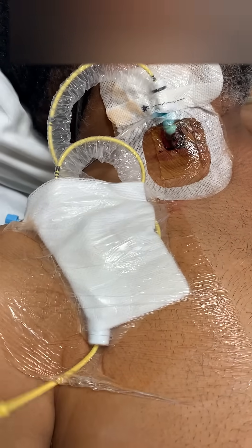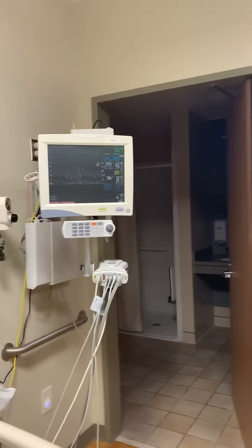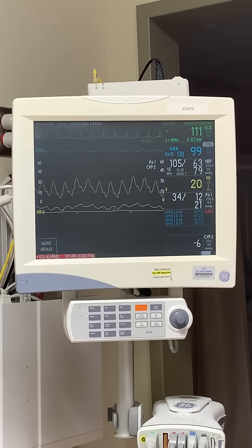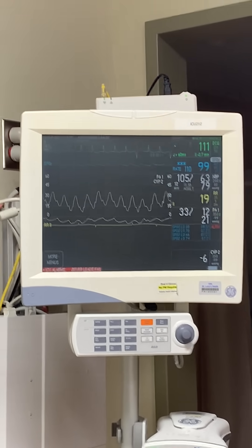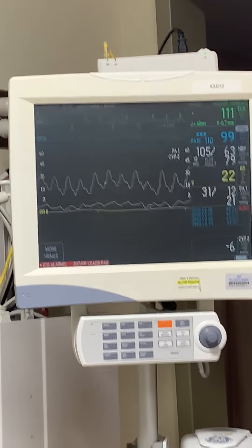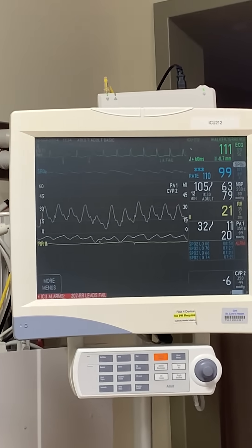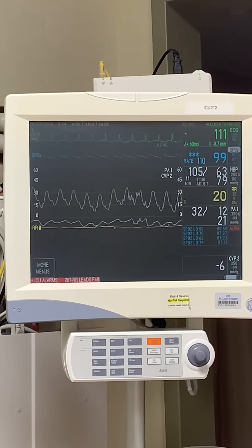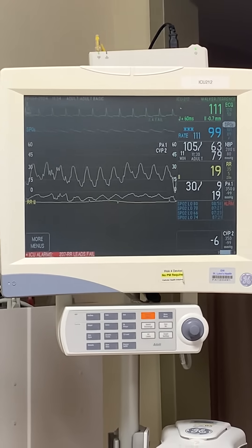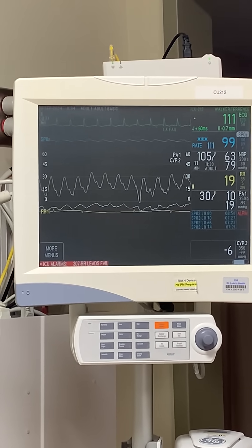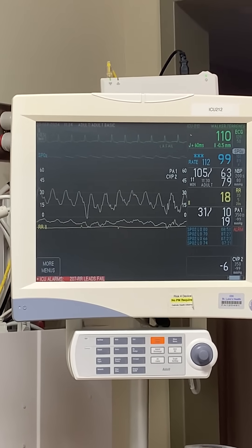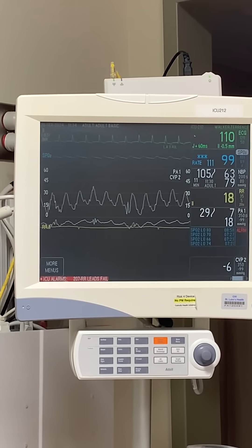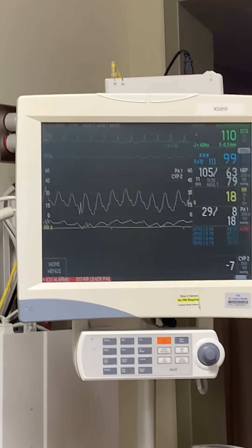Today we're removing the catheter. On the waveform on the monitor, you can see it's being transduced. As we remove the catheter, we're going to see some changes on the waveform. This procedure is sometimes done at bedside, mostly in the cath lab. You know the location of the tip of the catheter by looking at the patient's waveforms.